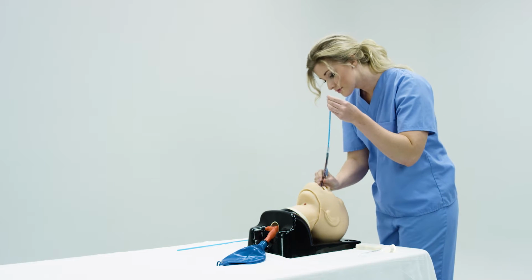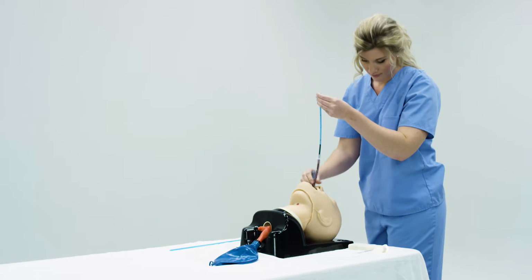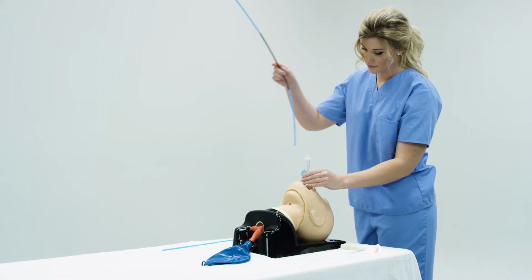The endotracheal tube is then passed over the bougie into the trachea and the bougie is then removed. The user can then begin to ventilate the patient. These steps together take seconds and with minimal effort.